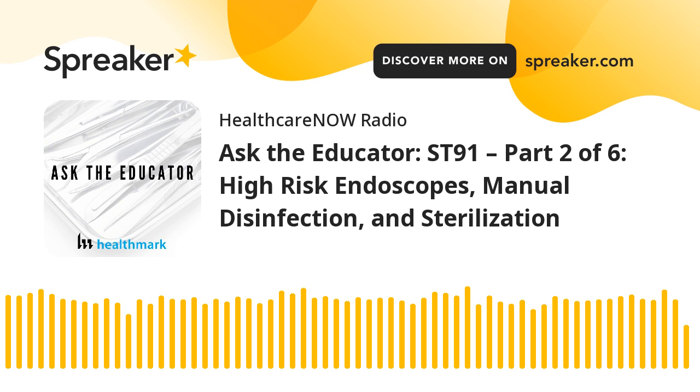And you've heard about them, right? The duodenoscopes with the infection outbreaks that happened, EUS having been more complicated along with the EBUS. They both have those ultrasonic transducers. Bronchoscopes going into the sensitive area of the lungs, more likely to have an infection risk there. Same thing with your ureteroscopes going up through the ureters into the kidneys, can easily transmit any organisms that might be left over or cause damage to the patient if the scopes were damaged themselves. Same thing with cystoscopes. So always high risk for those. But like I said, we also added there, and any other ones as determined by the facility.